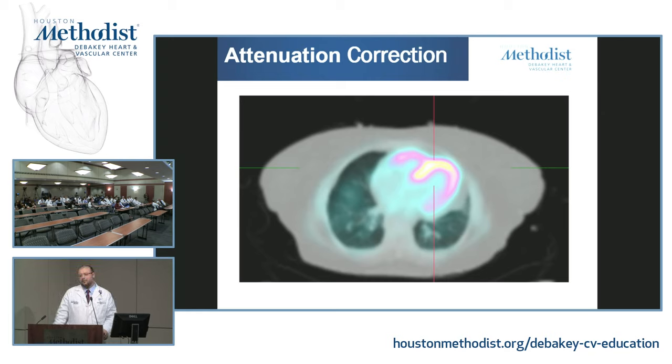Yeah, exactly. In the early days, electronics were not as good in terms of gathering all these randoms. But right now, our system has even higher sensitivity. Despite that, we're detecting way more randoms than trues. But the system has the luxury of throwing away everything it labels as random, and whatever is labeled as true, I'm still getting good image quality because my system has much higher sensitivity.